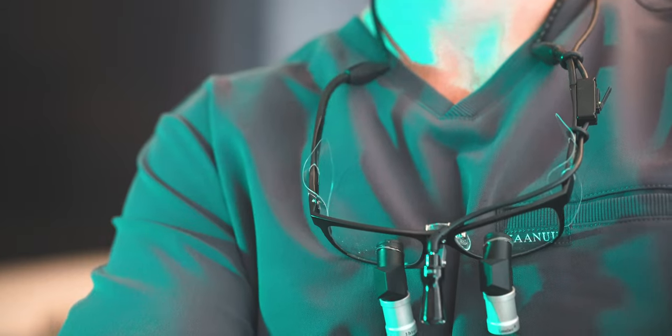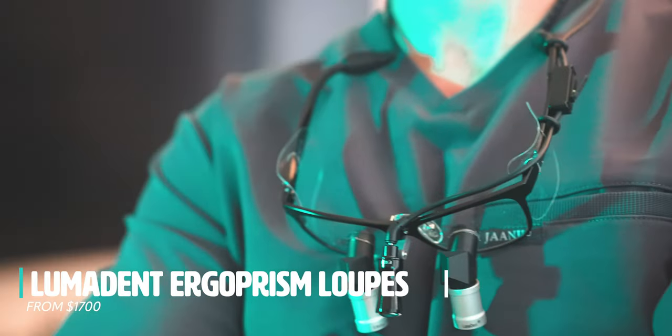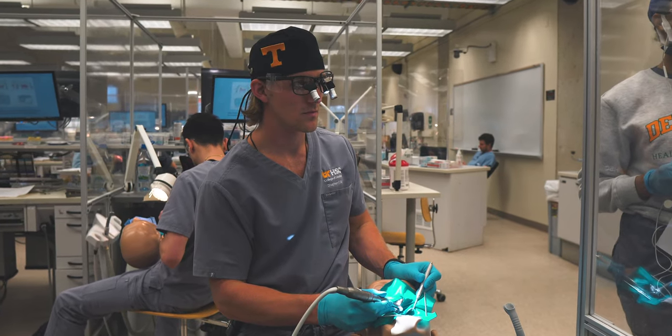Today's video is very long overdue. A couple of months back, this very kind and awesome company Lumadent was nice enough to send me a pair of their flagship loops — the very innovative ergo prisms — and it has been too long since I've given you an update. I've had the chance to use these loops in both a lab setting, a pre-clinical lab setting, as well as in our dental clinic here at school, treating my own patients as a third year dental student.